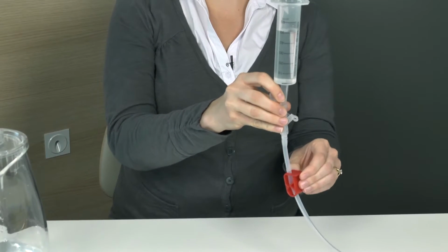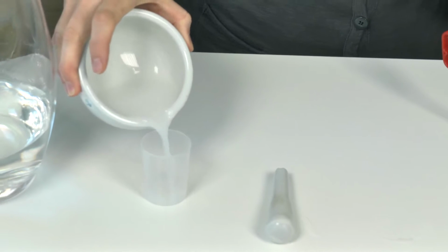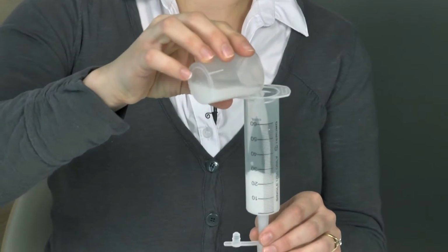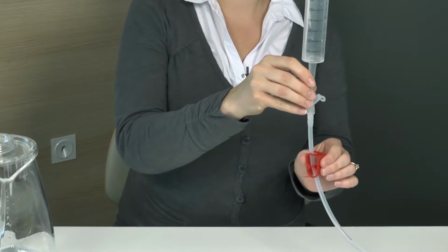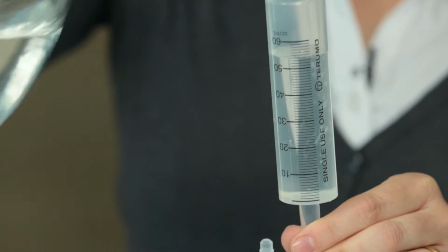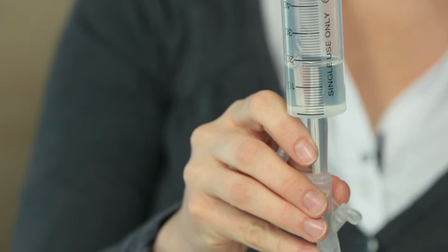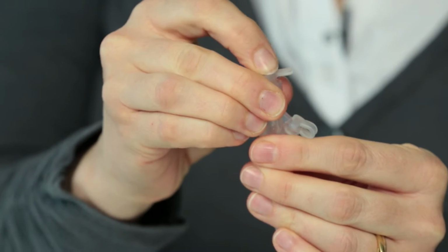It is important to flush your gastrostomy tube with 50 ml of tap water before and after each medication. Some medications can't be crushed. You should speak to your medical team if you're unsure how to handle your medications.